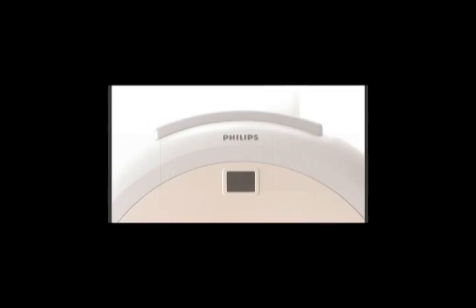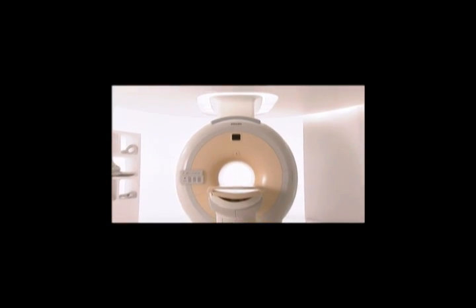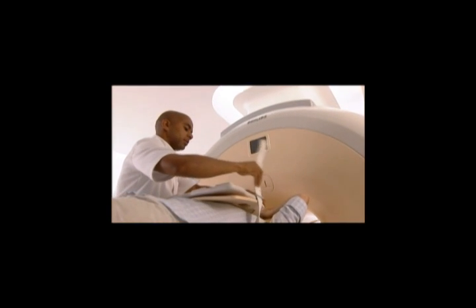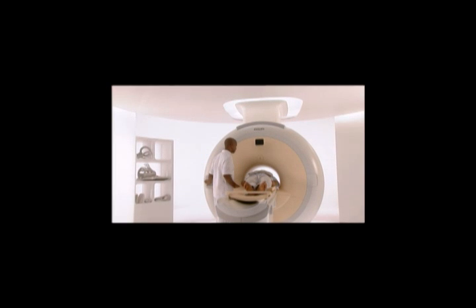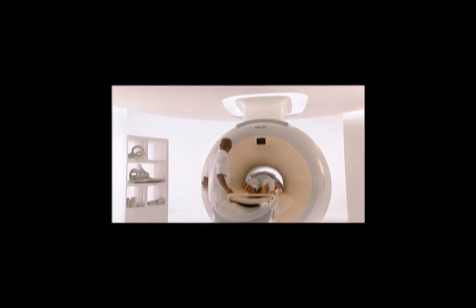Summary. Although MRI is an inherently safe diagnostic modality, provided that the appropriate safety precautions are observed, there are still some potential hazards, including the possibility of RF burns. Modern scanners have built-in safety features that are designed to prevent this problem. However, as more and more electronic devices are added to the patient, careful positioning becomes increasingly important.